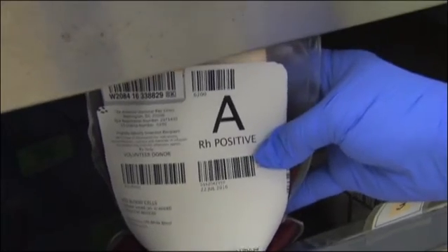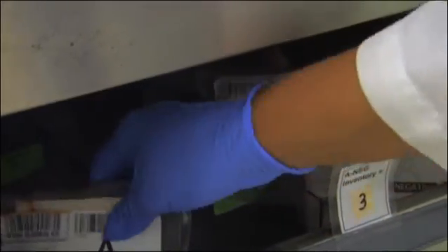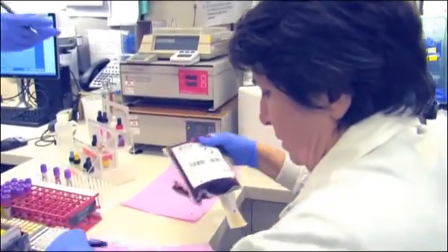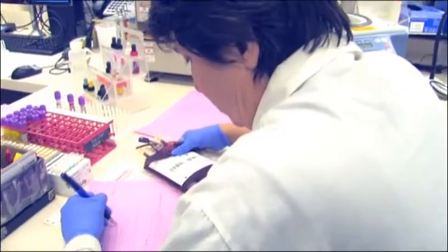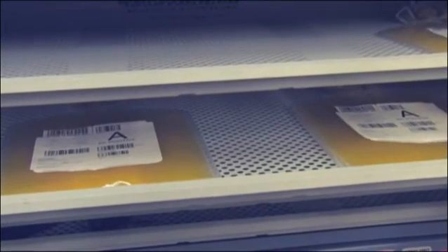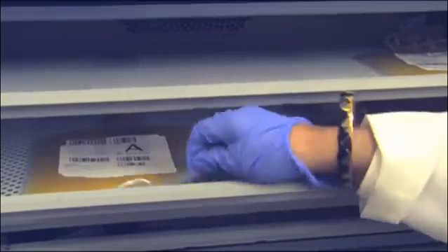There are 4 blood groups: A, B, O, and group AB. We need to make sure that if you're group A, we give you group A or a compatible unit of blood. Our other primary goal is to ensure that there is enough blood inventory in our blood bank for our hospital here. One of the other products that the blood bank is responsible for is the transfusion of platelet pheresis products. Platelets are obtained from blood donors through automation, and they're used to prevent bleeding in patients and to treat critically abnormal platelet counts.